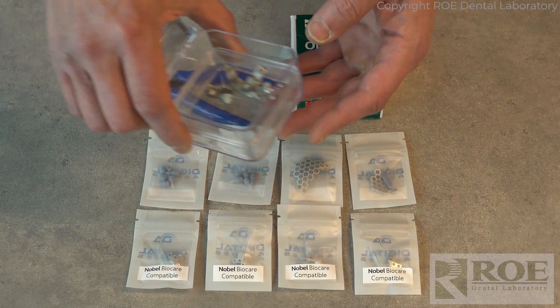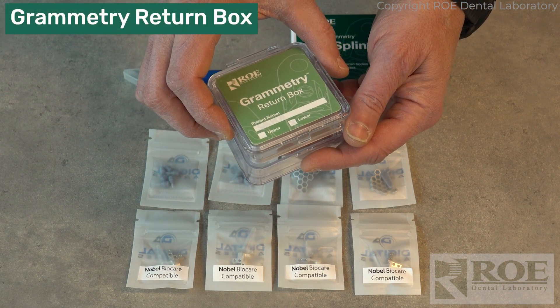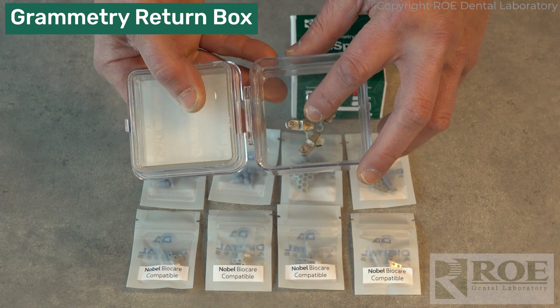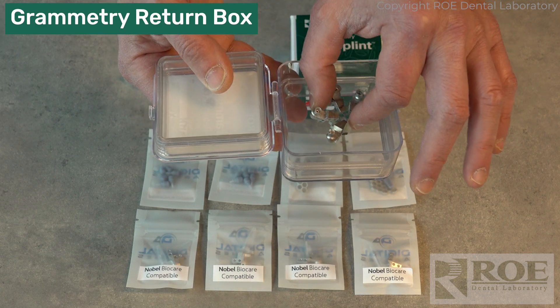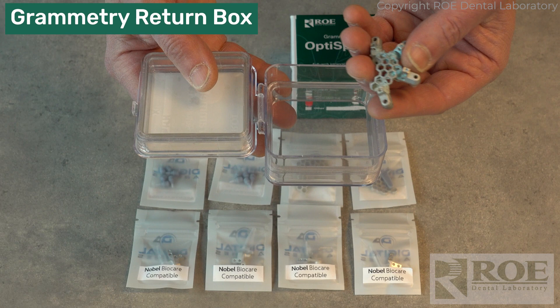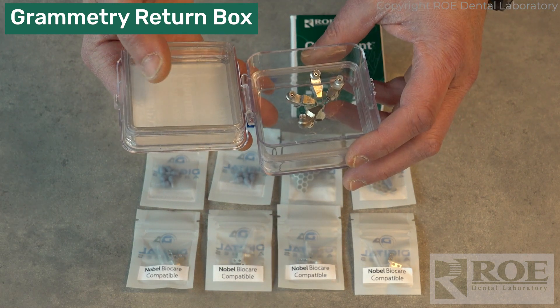When you receive your kit you'll also receive this compression package so that you can ship your OptiSplint to the laboratory. It has a nice soft packaging with a little bounce to protect it while it's shipping, or even while you're storing it in the office while you're waiting for the restorative phase.